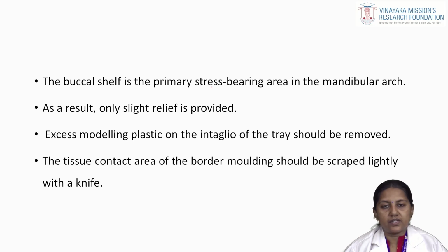So, as we keep on repeatedly telling, the buccal shelf is the primary stress bearing area in the mandibular arch. So, there you give only slight relief. Excess modeling plastic on the intaglio surface should be removed and the tissue contact area of the border molding should be scraped lightly with a knife.